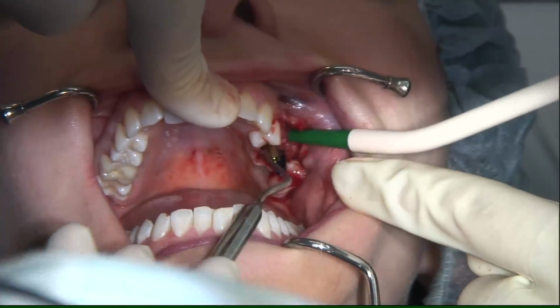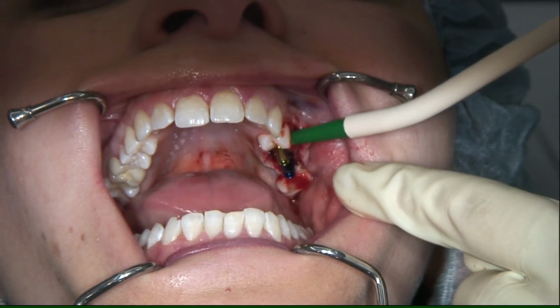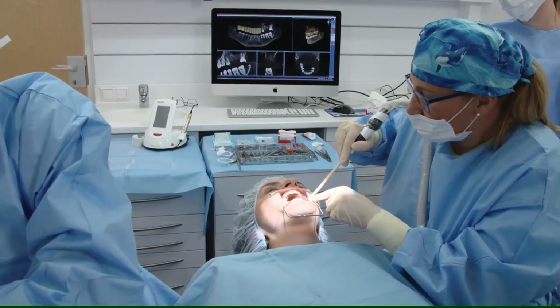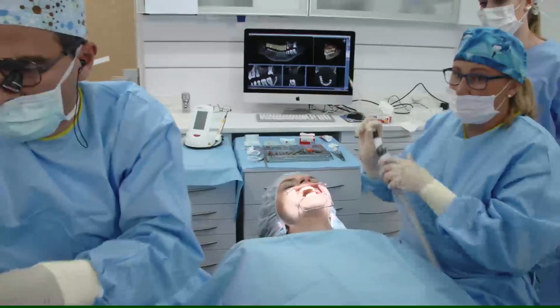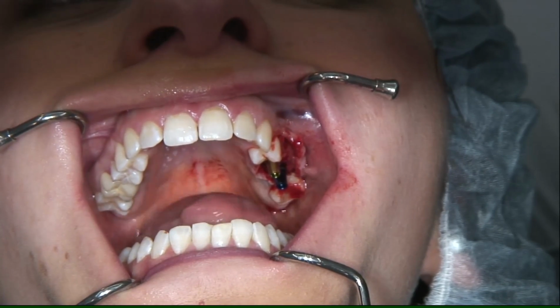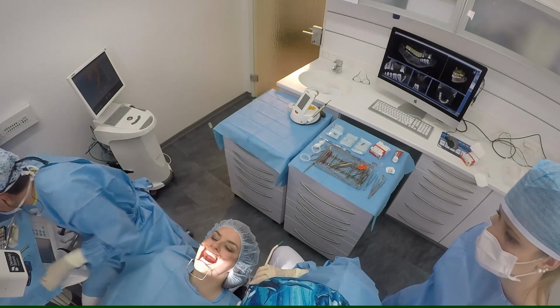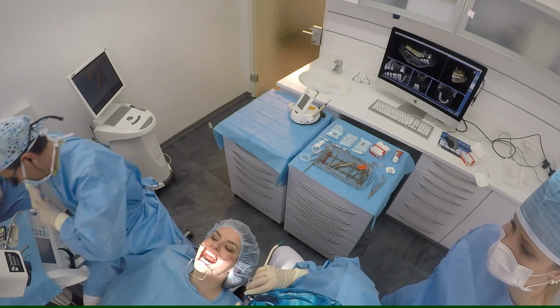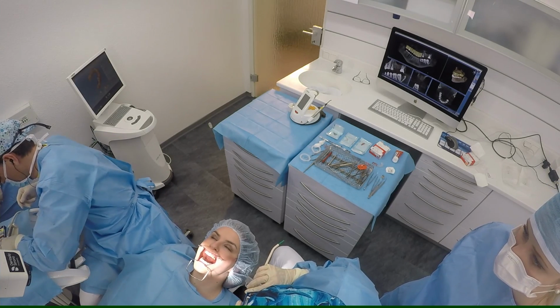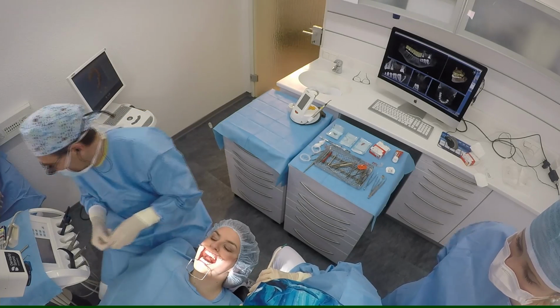The wish of the patient was to get a minimally invasive procedure, and at the same time an operation with the highest level of safety. What you see on the implant is the temp base.